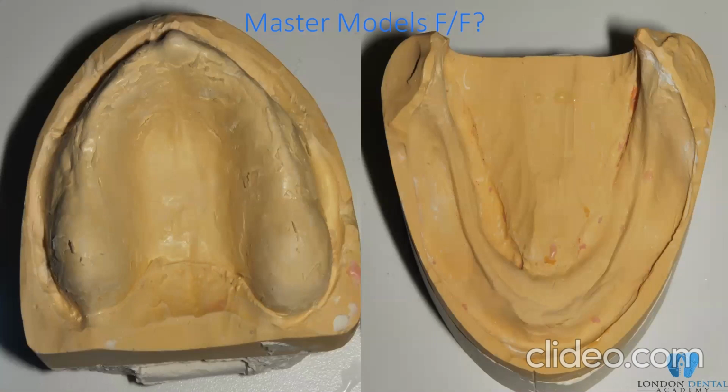I would not advise my technician to cut or to adjust the model at any stage at all. To the contrary, I want them to keep the models as they are in the impression, and then we deal with that at a later stage. The lower model even looks nice, and beading and boxing is always recommended, as you can see.